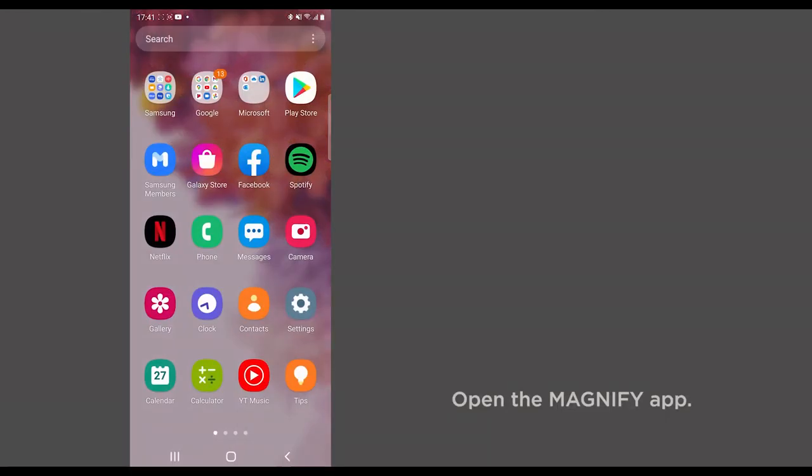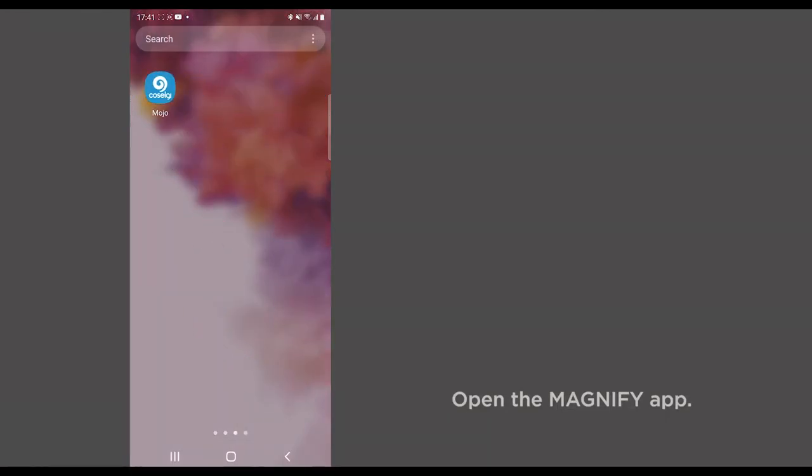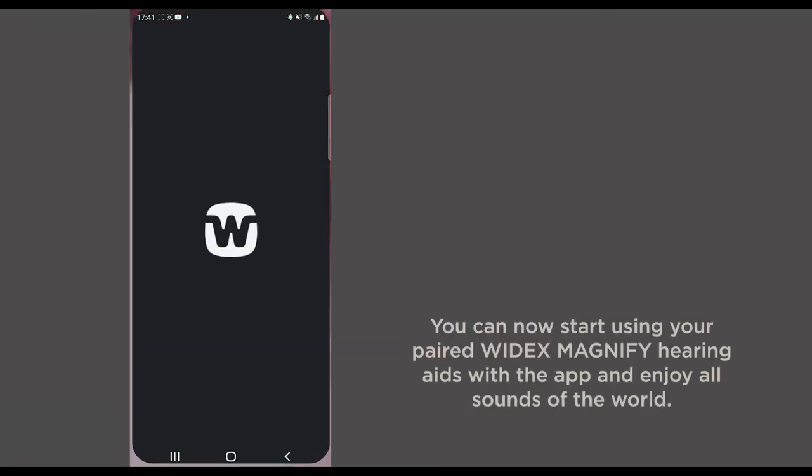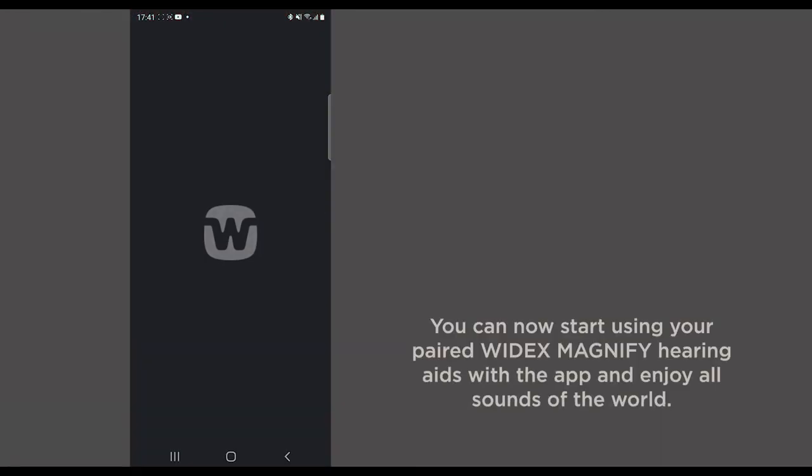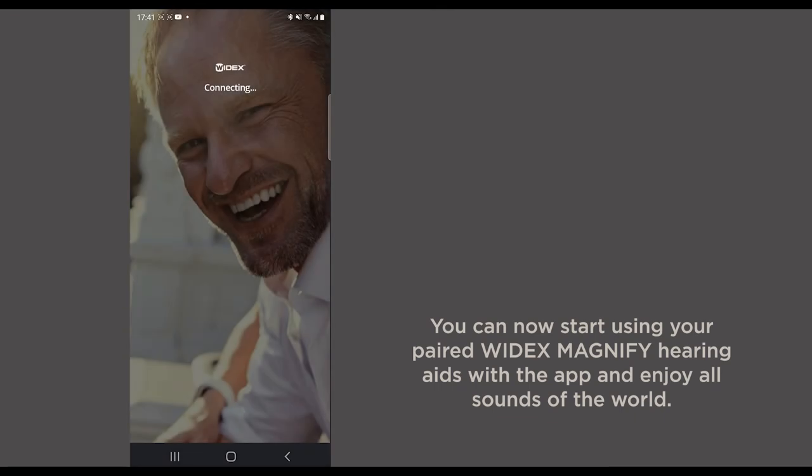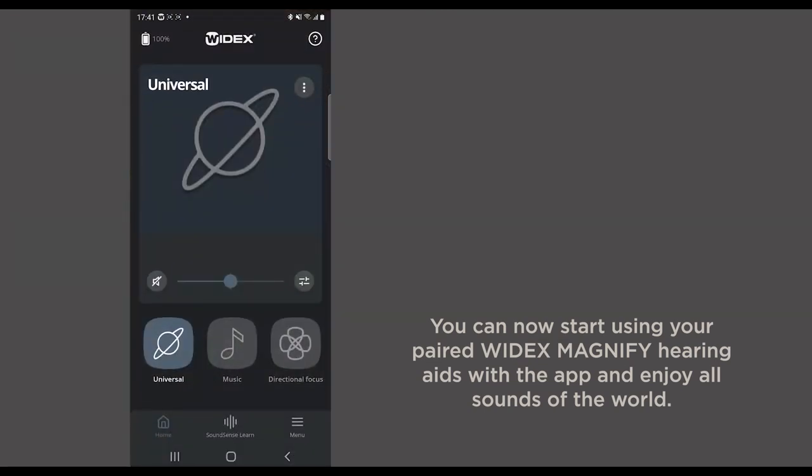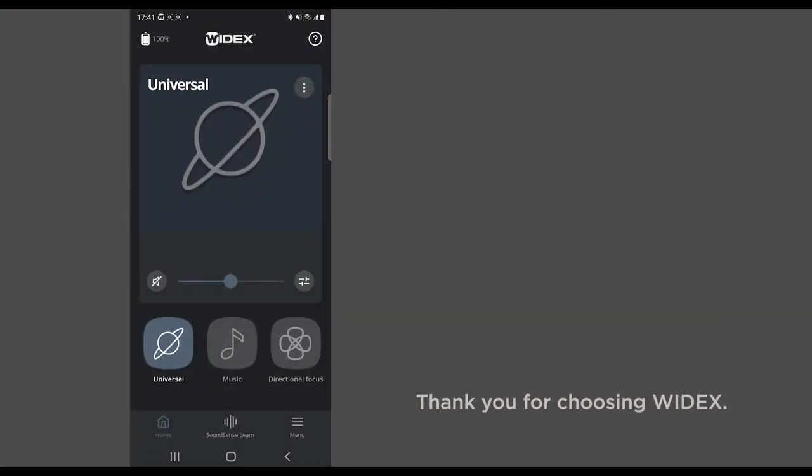Open the Magnify app. You can now start using your paired Widex Magnify hearing aids with the app and enjoy all sounds of the world. Thank you for choosing Widex.